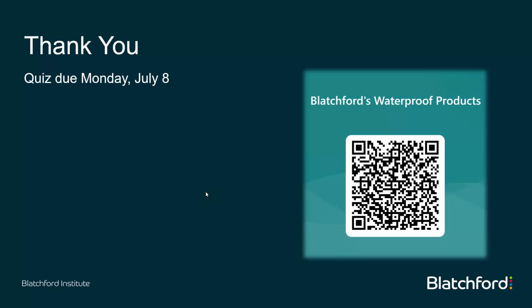Is a BMK2 waterproof? It is not waterproof. That is our mechanical K2 knee, and it is not waterproof.